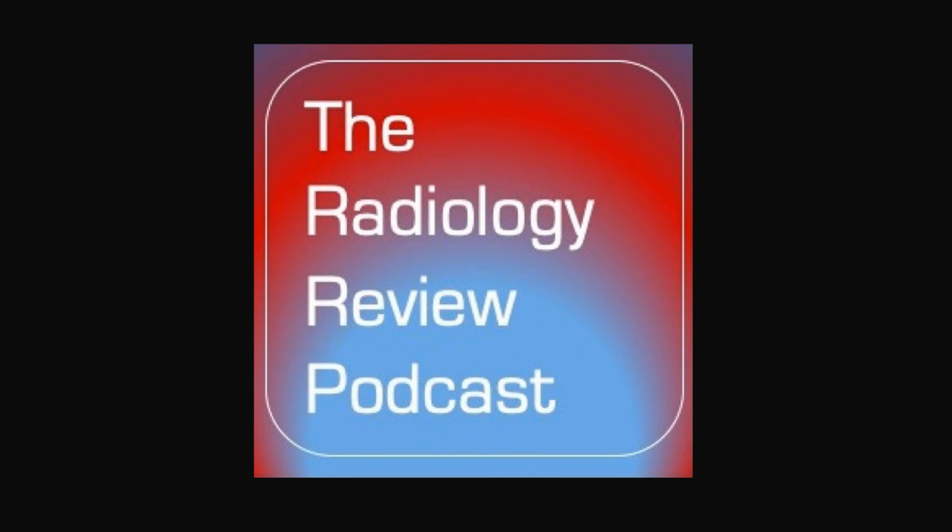First question. What is the cause of reverberation artifact on ultrasound? One more time. What is the cause of reverberation artifact? The cause of reverberation artifact is having two echogenic structures, which are in close proximity, that cause the sound wave from the ultrasound transducer to bounce back and forth between the echogenic structures. As the sound wave bounces between the echogenic structures, this causes artifactual signal in which the length between each reverberation is equal throughout the visualized image.